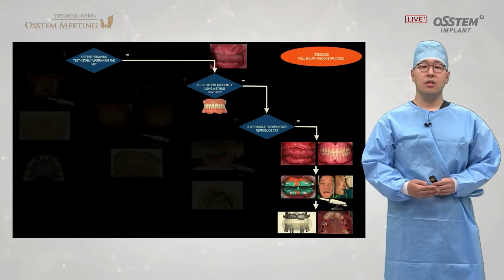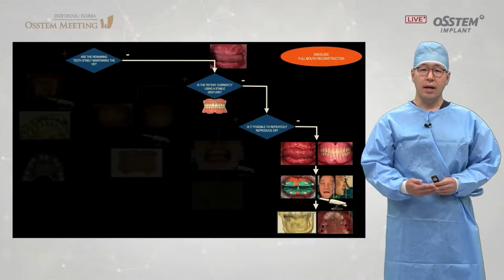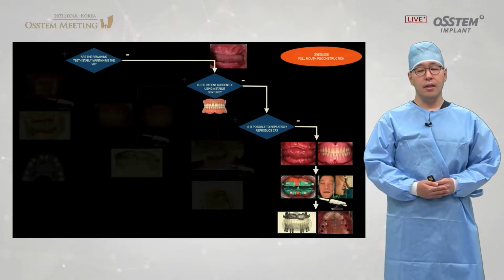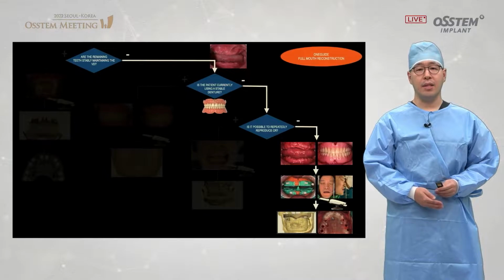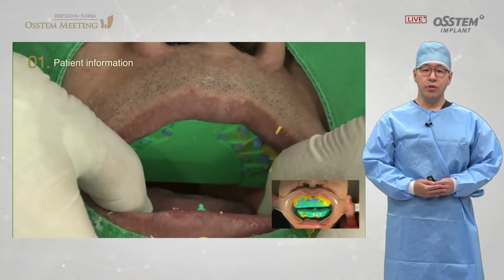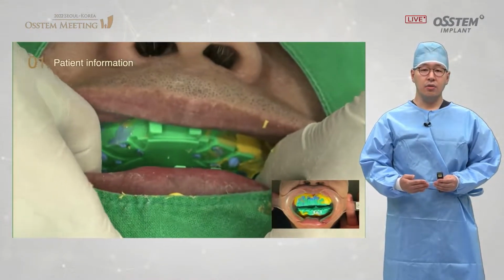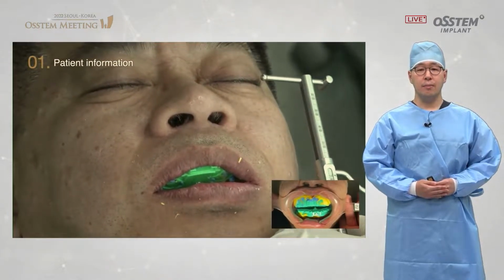Dental digital system is used to make a treatment denture using digital approach to stabilize the mandibular position. If the denture fits, that would be scanned and it would be reversed to fabricate a guide. First, the impression needs to be taken. The Denka system has stylus pins in the stock tray.